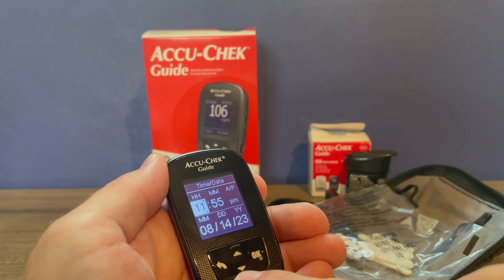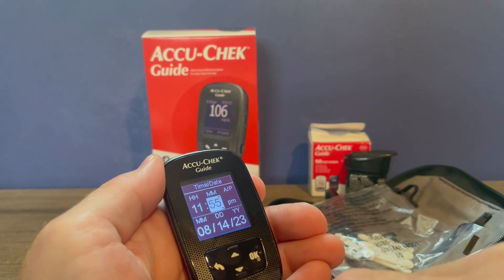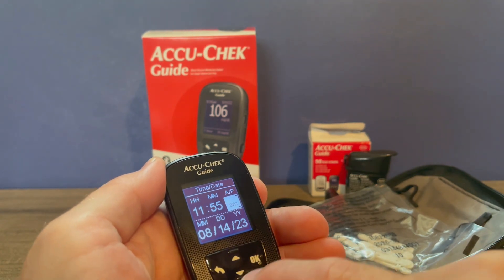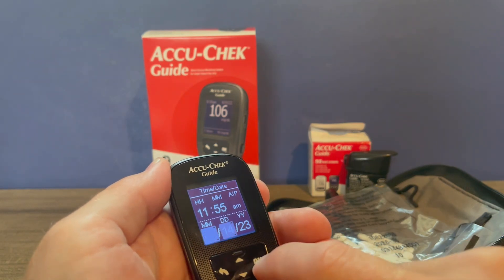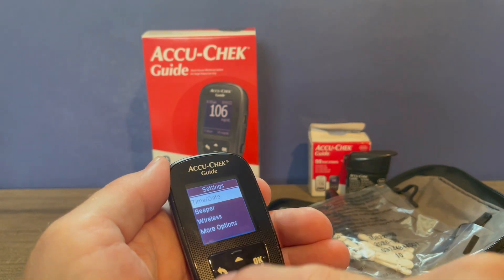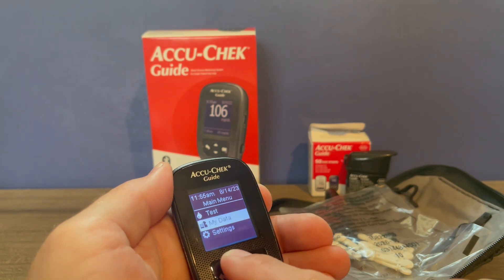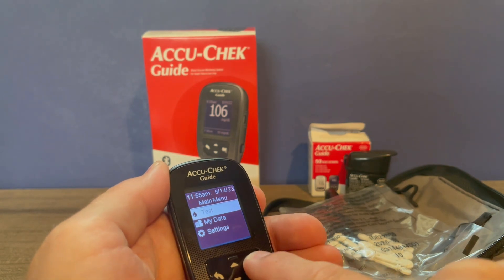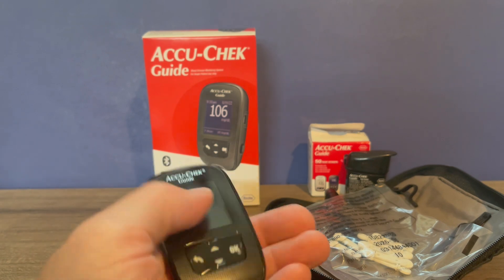You can adjust to your current time, starting with hours. Hit OK to go on to minutes and then on to AM or PM. Select OK and then you're on to the month, the day, and the year. Once your time is set, to get back to the main menu you just press the back arrow and you're ready to go. You can hold down the OK button to power off the meter — hold it down until the bar is full and your meter is powered off.